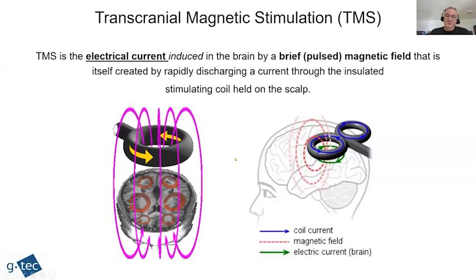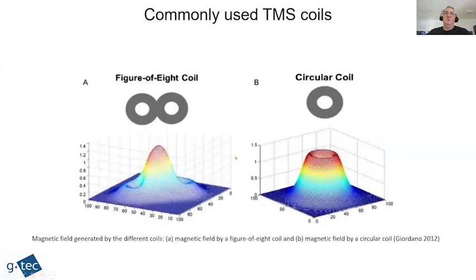So you could also notice, probably from literature or maybe on the YouTube videos or maybe visiting labs, there are different coils, but you mostly see people using this 8 or butterfly coil for the TMS-EEG experiments, and that is why, because it generates the field which can be better directed at the target point in the cortex.